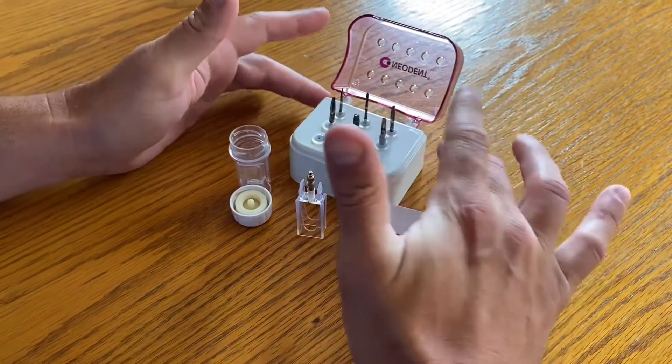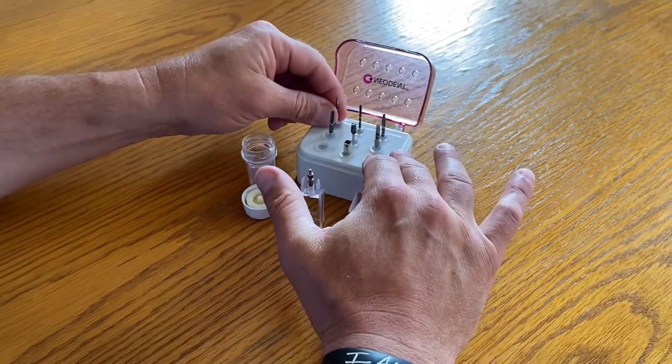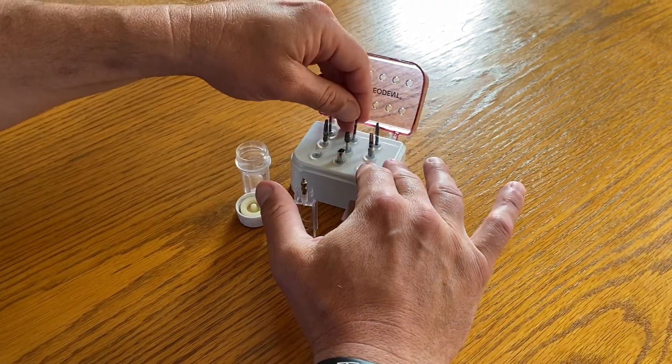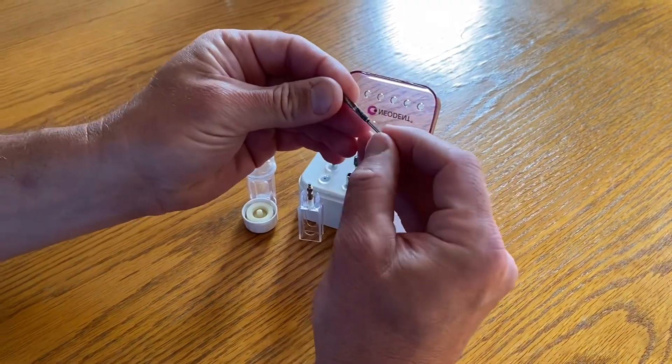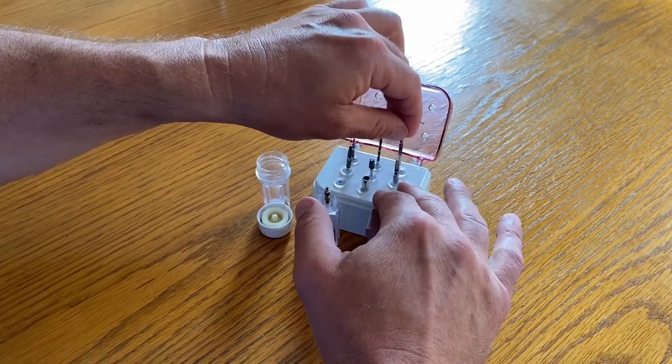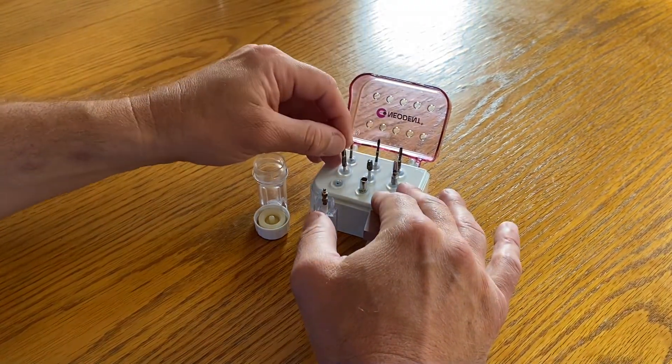How do we put this in? It's a very exact process. We have the spear, your two millimeter, you got your more narrow drill, it's a 3.5 for softer bone.